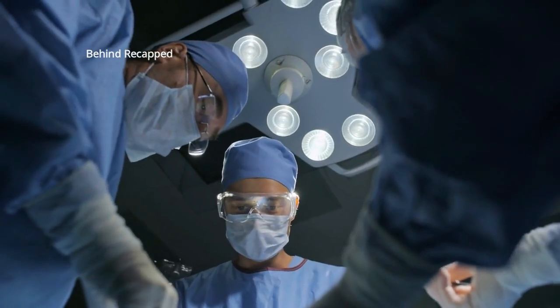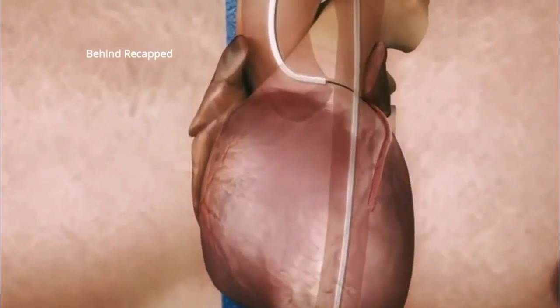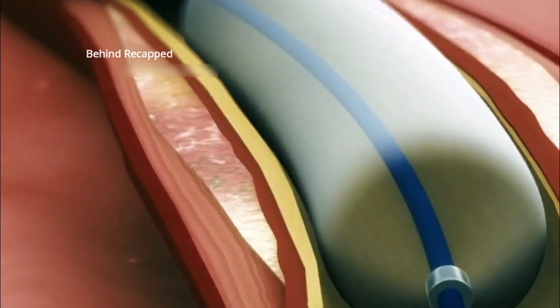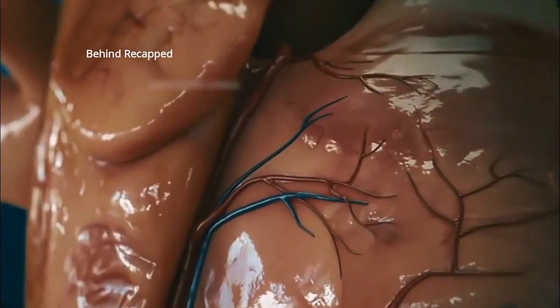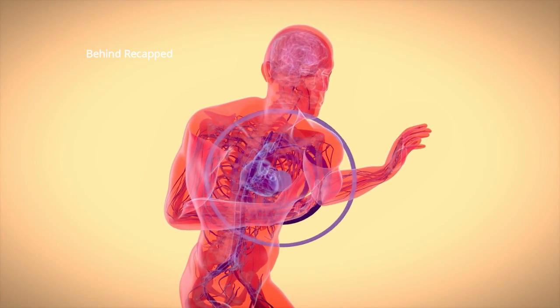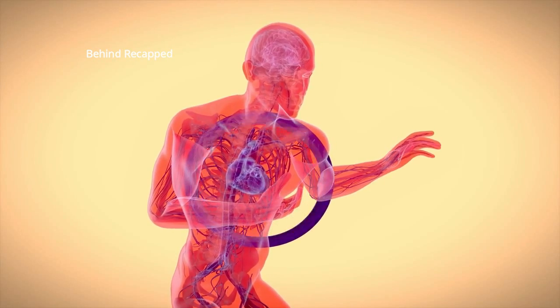In the term angioplasty, angio means blood vessel, and plasty is reshaping. An angioplasty is a surgical procedure to open the blood vessels that deliver blood to your heart muscle. Those blood vessels are called coronary arteries. Angioplasty is a traditional treatment for coronary artery disease, CAD, and coronary heart attacks.